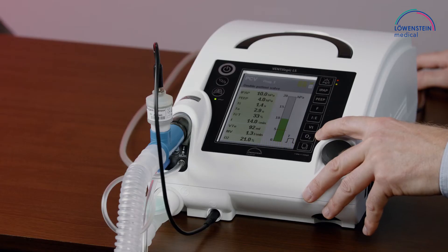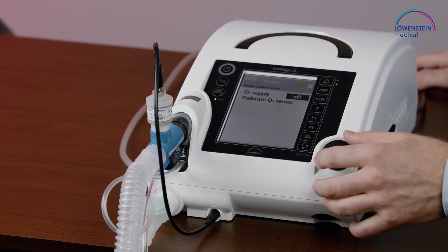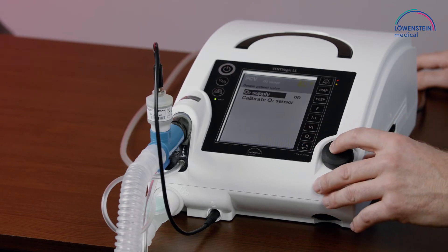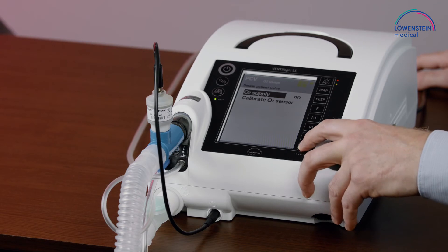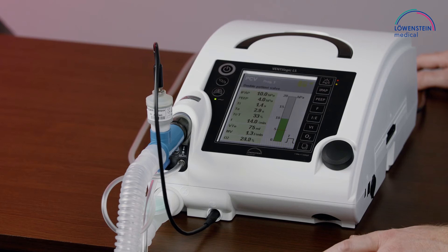We can go to O2 again. Switch on the oxygen supply, and now we will see that the oxygen concentration will rise and increase.